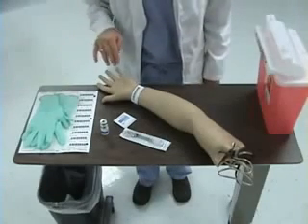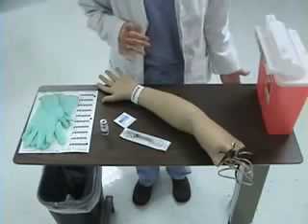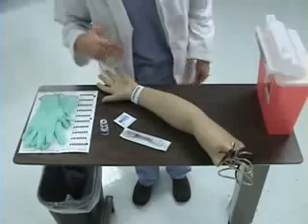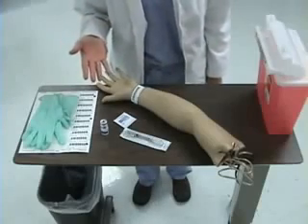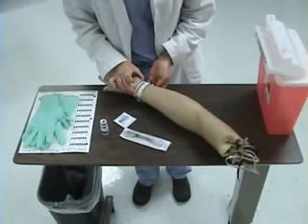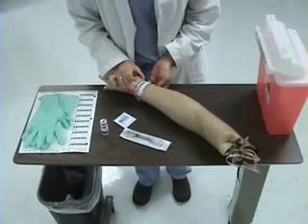I will begin by entering my patient's room, washing my hands, and then I will identify my patient. I will begin by introducing myself to the patient. Then, as I'm looking at the identification bracelet, I will ask my patient to state their name and date of birth.